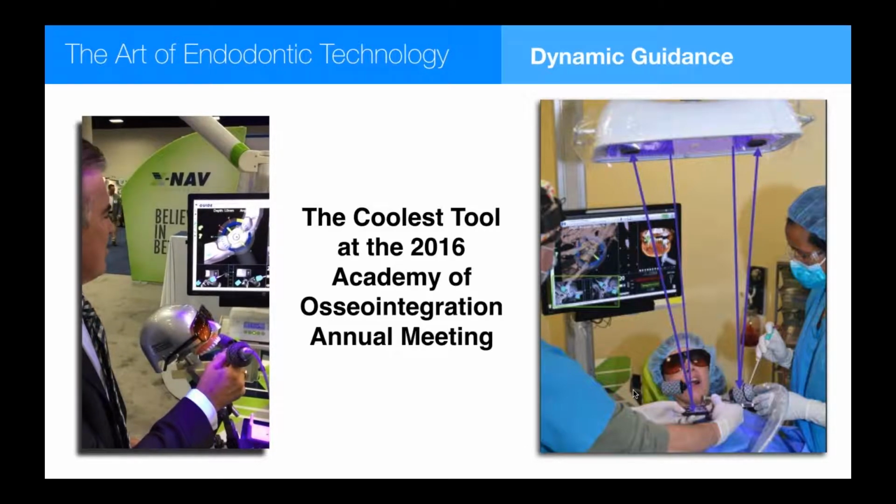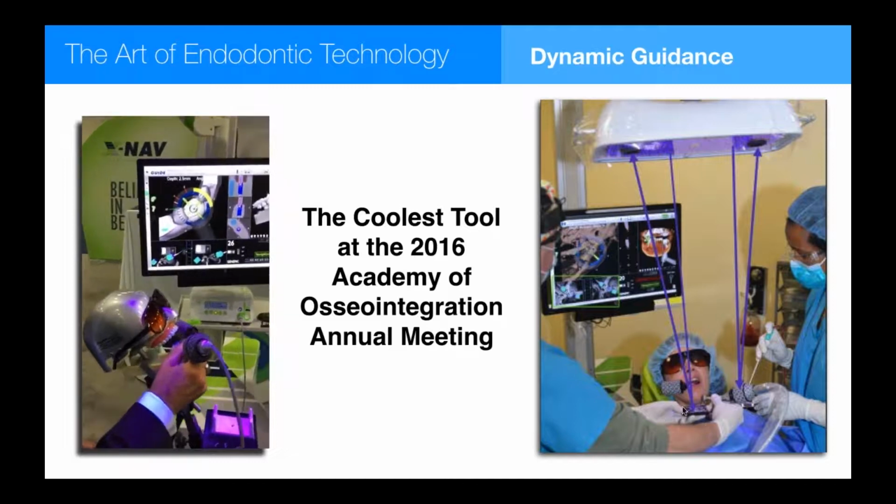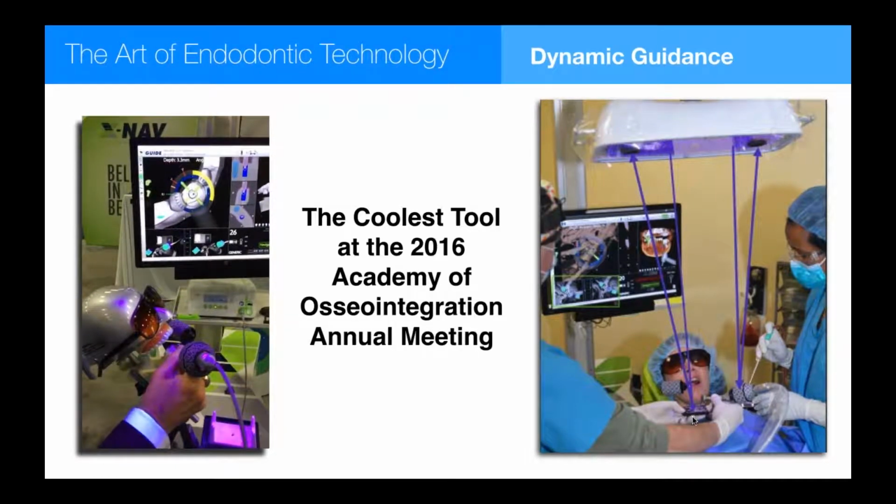So there is an overhead twin light system that's watching fiduciary coded patterns on my handpiece and on the patient's jaw. And so this computer system knows where my burr tip, drill tip is compared to every part of her anatomy in her jaw. And I literally watch the monitor while I'm doing the procedure.